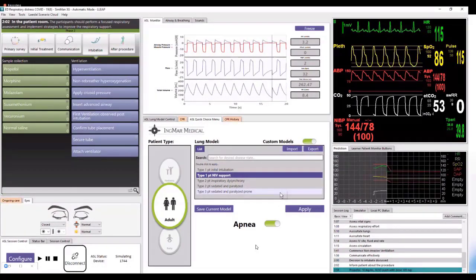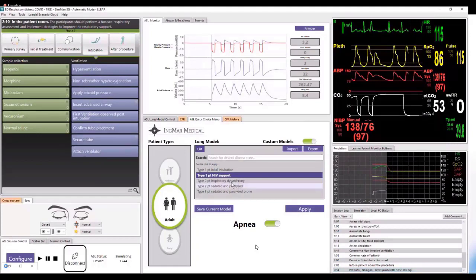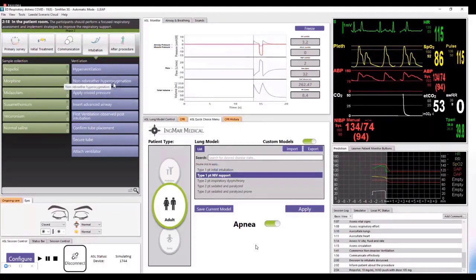For today's example, let's give propofol. If we gave 20 milligrams of propofol, it has a different response to giving 100 milligrams of propofol. As you notice, you will see that the eyes have closed and the patient has stopped breathing.